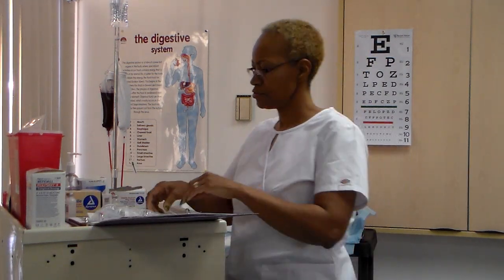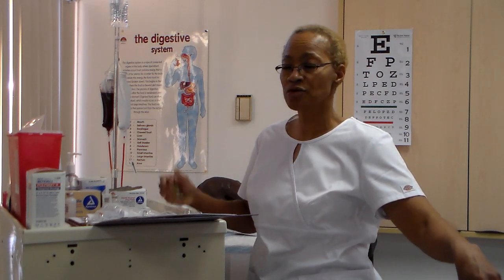If new tubing is required, spike bag or bottle with IV tubing and prime tubing. Second check. For what we're going to do today, I don't need new tubing. We have tubing in the room. So I'm taking in a brand new medication bag. I'm going to be taking that bag down, keeping my same tubing. If it was 24 hours or whatever the policy is for your facility, then you would be putting new tubing in. But for this patient, I don't need new tubing. I'm just hanging a new bag.